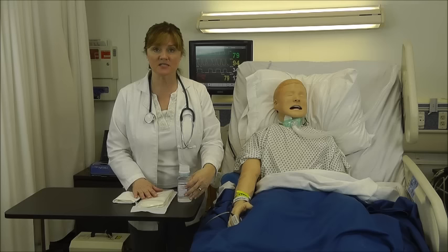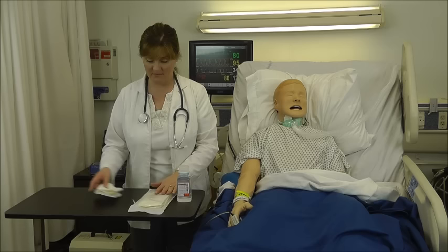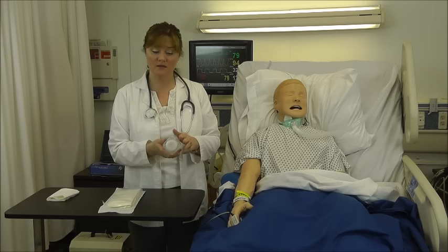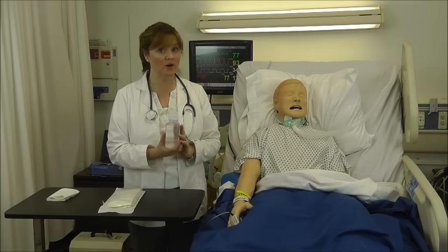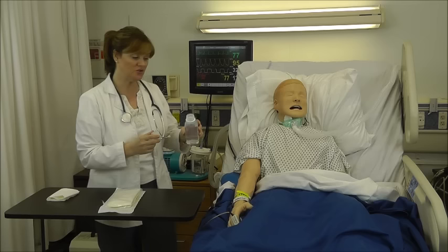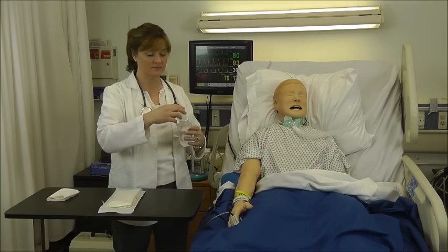Your tray table, because this is sterile, needs to be waist high and clean and dry. I have a new bottle of normal saline. I've checked the expiration date. The color is clear and there's no sediment. If this had been opened, it should have a date, time, and someone's initials. And this can be used for up to 24 hours. If you use a bottle that has been opened, make sure that when you open it, over a trash can or sink, rotate the bottle as you pour. And we call that lipping the bottle. My bottle's new, so I don't have to do that.